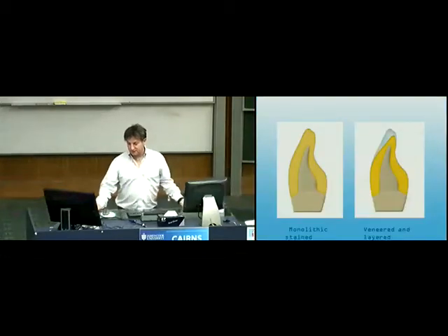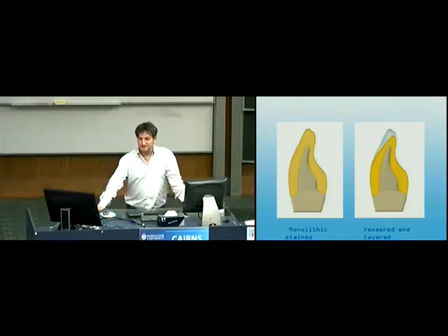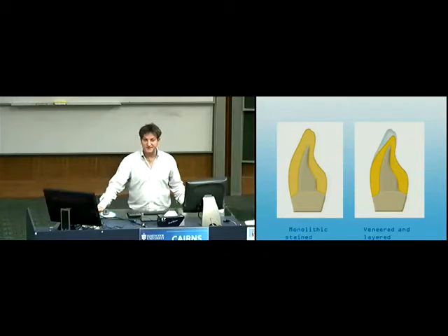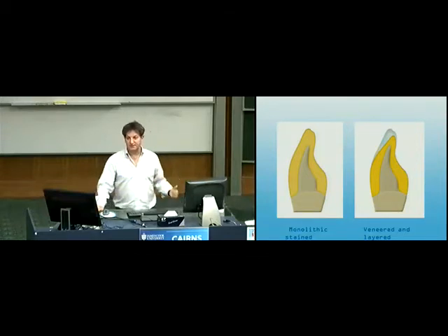One of the things that I'll be mentioning quite a bit tonight is the difference between monolithic restorations and veneered and layered. And this goes for molars, premolars and anteriors as well. Again, I want you to understand what you're getting. From your lab, or if you work with us, you can actually ask for a stained monolithic crown, or if you want something veneered and layered, I want you to understand the difference in the mechanical properties.